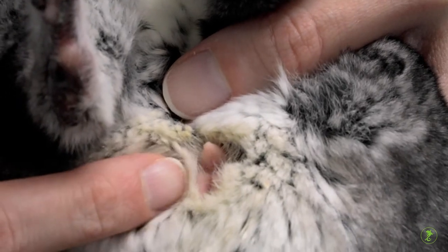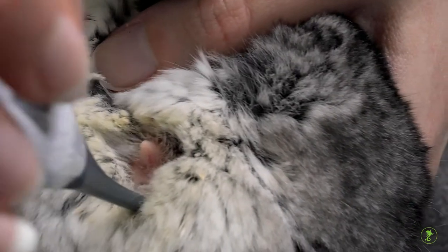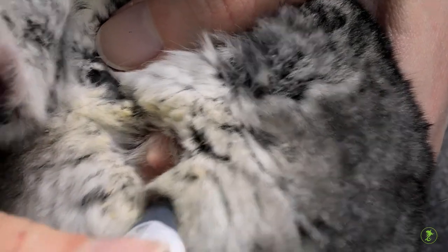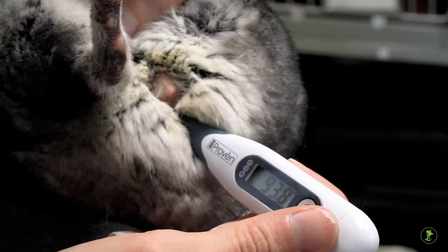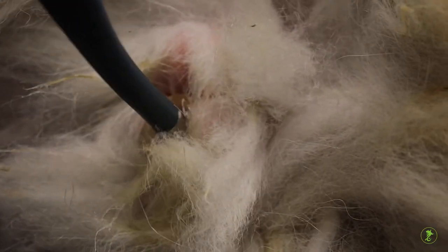For some sick exotic mammals, monitoring body temperature may be an important tool to help keep track of their progress. Just like in humans, body temperatures can be too high or too low.